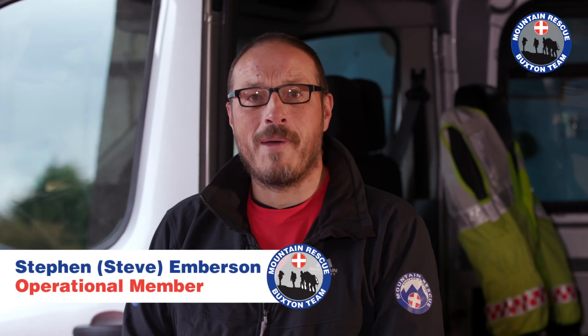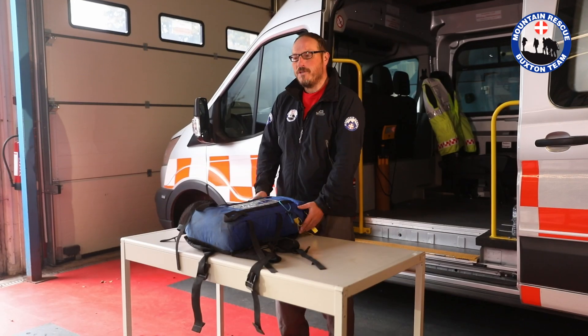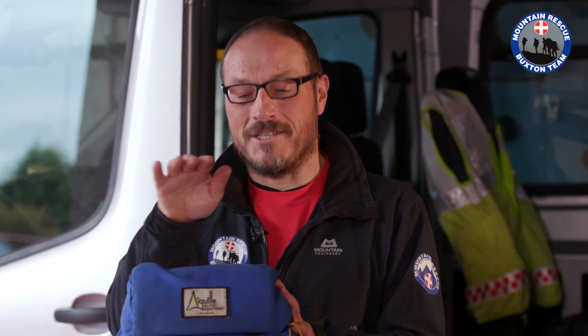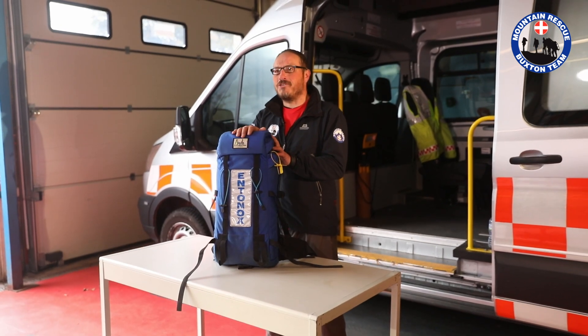Hello, I'm Steve. I'm a Hill Gang member from Buxton Mountain Rescue Team and today I'm going to give you a very brief video about what we call Bag 3, which as you can see contains Entonox. You might know Entonox as gas and air or laughing gas. I know it as a mixture of nitrous oxide and oxygen, and it's pain relief.